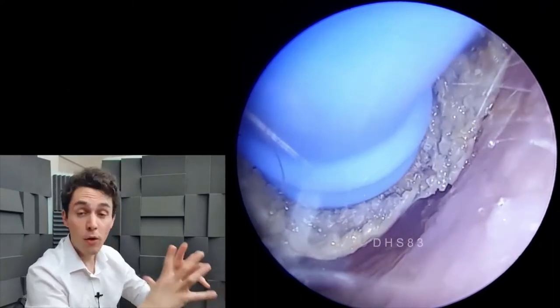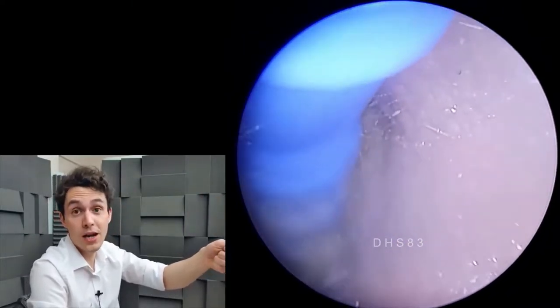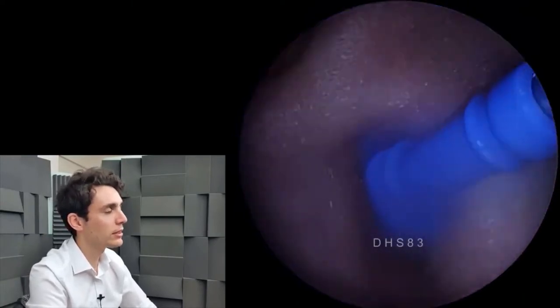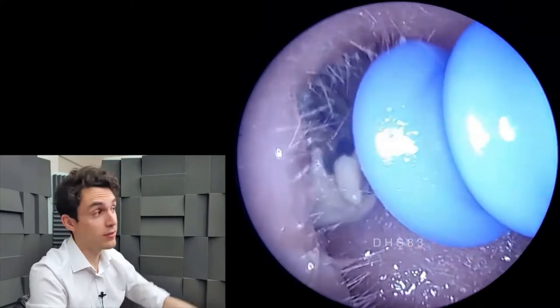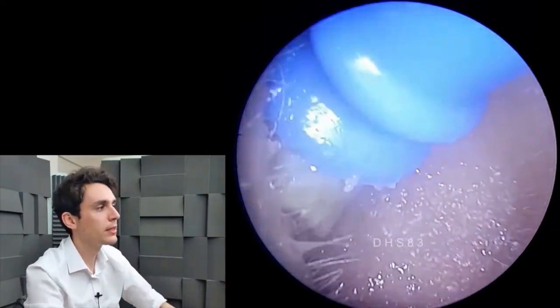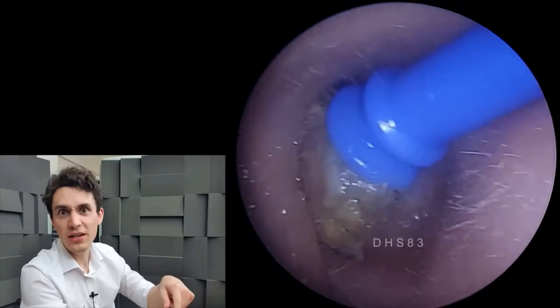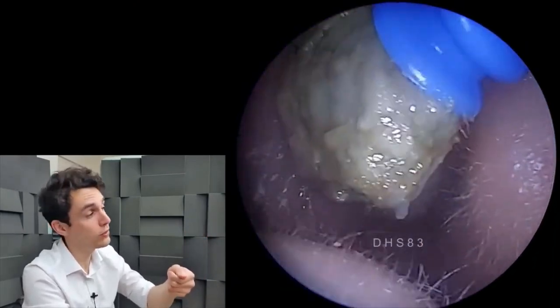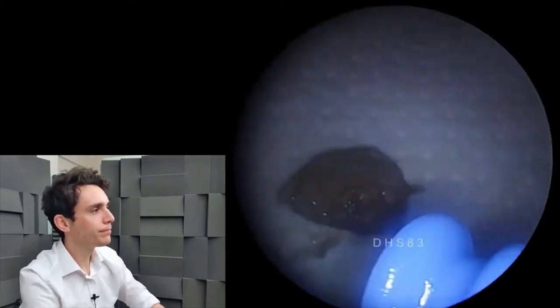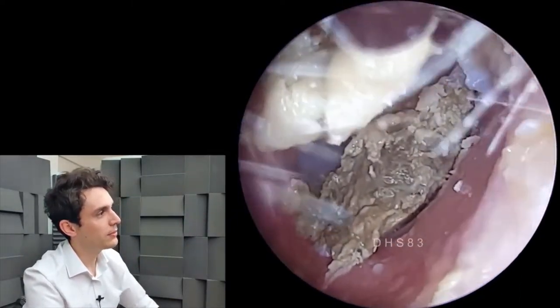You can see it's latched on now and the silicone tip deforms around the object you want to pull out. I'm not having to wiggle or faff around — I'm literally just very slowly dragging it. I'm doing it slowly so as not to cause barotrauma to the eardrum, which I was slightly worried about. Barotrauma means trauma created by pressure, and pulling a very firm occluding plug can pull on the eardrum due to the air pocket between the plug and the eardrum. So you can see here I'm latching on again. The handle is fenestrated — it has a hole — and when you want to increase the suction power you close the hole with your thumb.